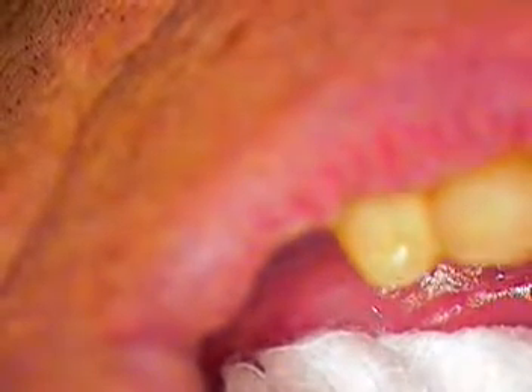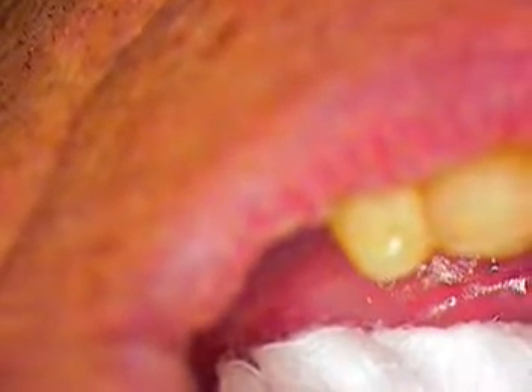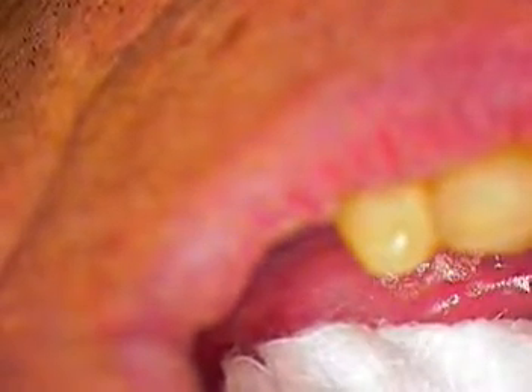Hello again, we're back with Larry, our patient. This is a rescue case for a local dentist. She referred Larry to me, and we have a couple of fractured metal screws. These are titanium screws, versus the previous videos that we've done with IMZ, which have a lot of plastic components.